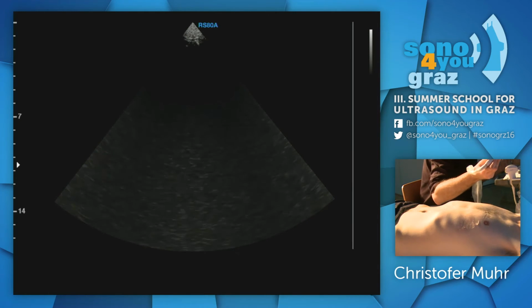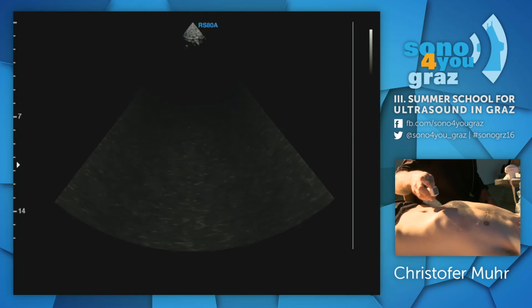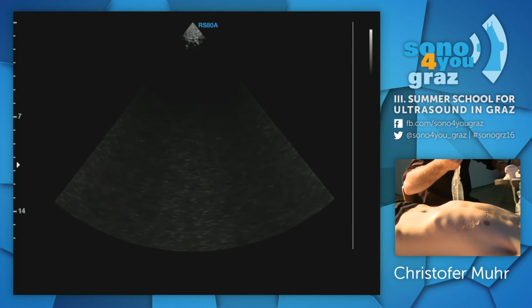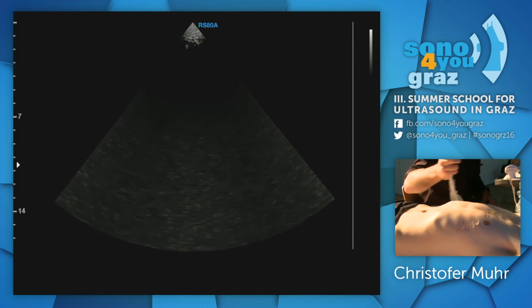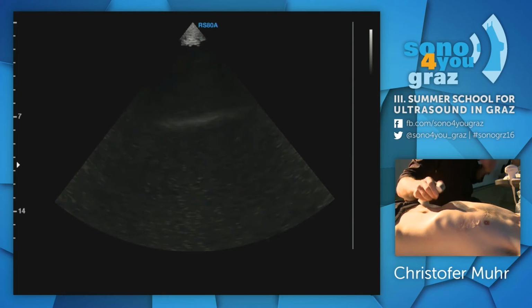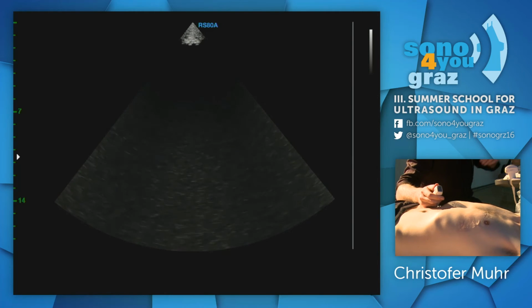So the idea with RUSH, right, is that we have... okay? Put on the timer now. Does anyone have a timer? You? Okay. So let's see how quickly we can do this. But we need 2 judges that say that the image is okay. You can just sit there, and then you say the image is okay, and then I continue, all right? Do you understand? Okay?